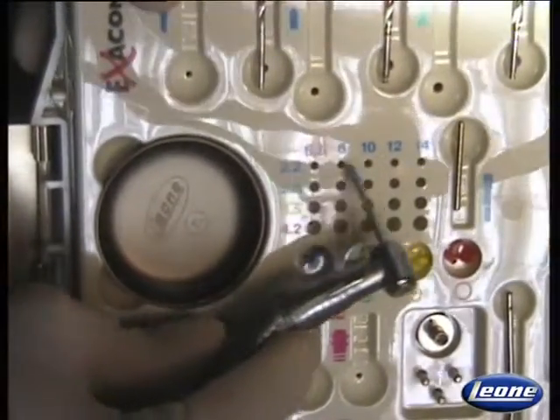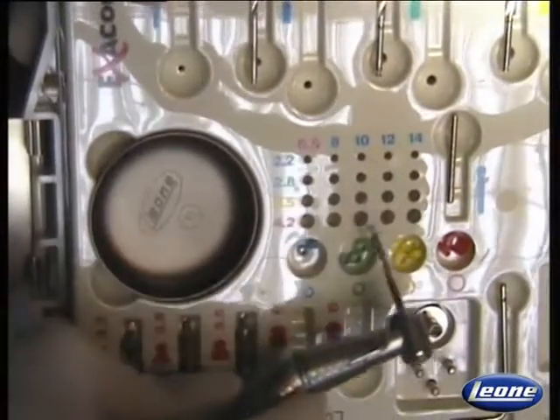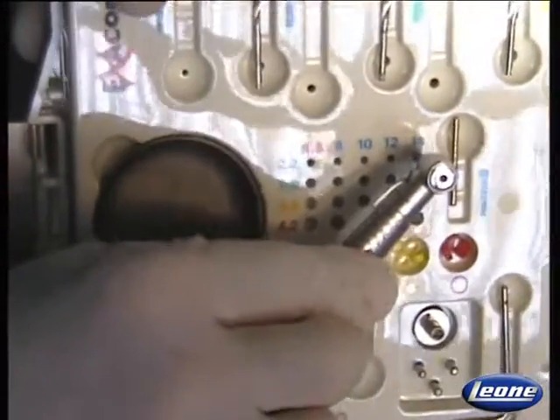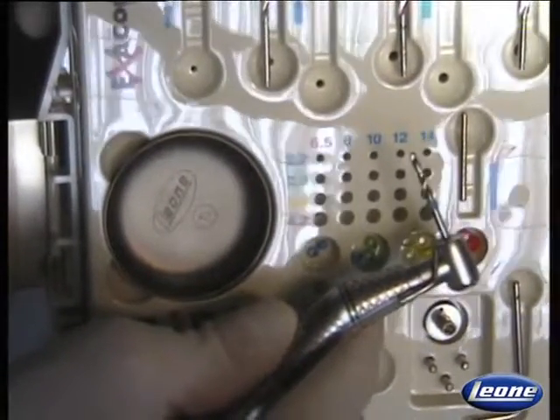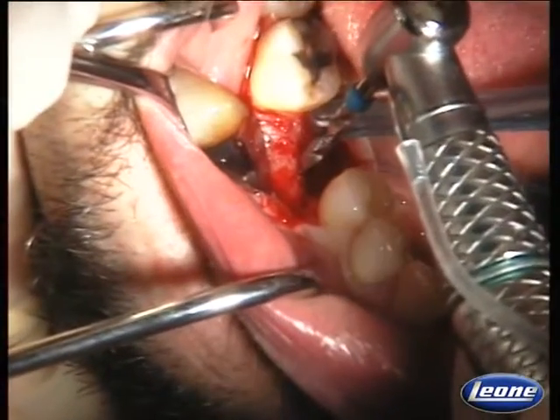In this area of the surgical kit, we have a drilling chart with the different drill diameters and length. I place the drill into the 14 millimeter hole of the pilot drill, push it all the way down, and the ringlet is automatically driven into the 14 millimeter position. Now I have the depth indicator at 14 millimeters. It can be seen very well. We go into position and start drilling.